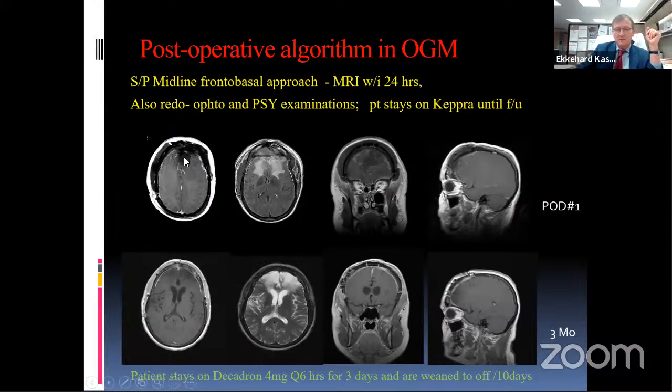This was the immediate post-op resection, with persistent edema on the frontal lobe. Three months later, the frontal lobe has nicely recovered and filled the gap, but the edema actually remained because it wasn't just edema, it was loss of some of the cortical surface vessels, and thereby the patients often continue to have significant executive dysfunction in these cases.